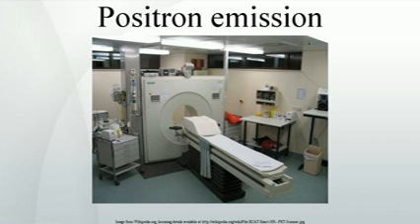In modern PET-CT scanners, three-dimensional imaging is often accomplished with the aid of a CT X-ray scan performed on the patient during the same session, in the same machine. If the biologically active molecule chosen for PET is fluorodeoxyglucose, FDG, an analog of glucose, the concentrations of tracer imaged will indicate tissue metabolic activity by virtue of the regional glucose uptake.